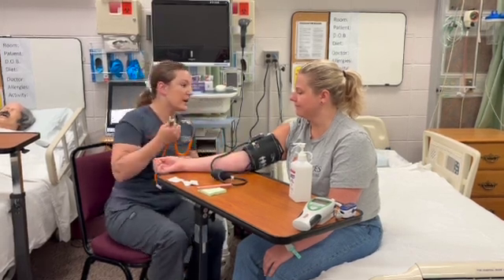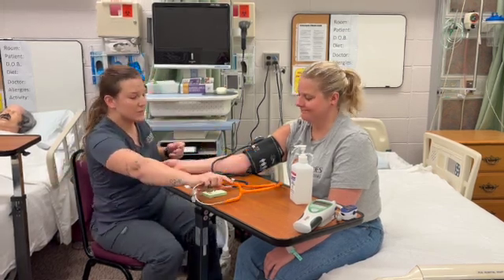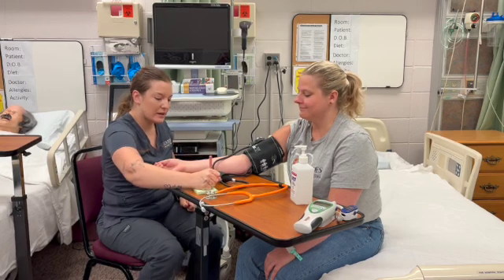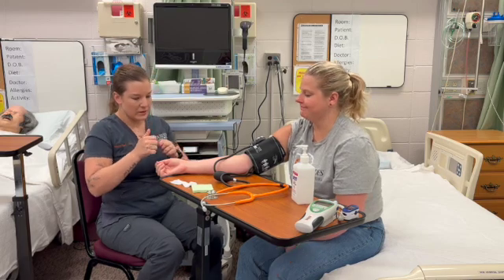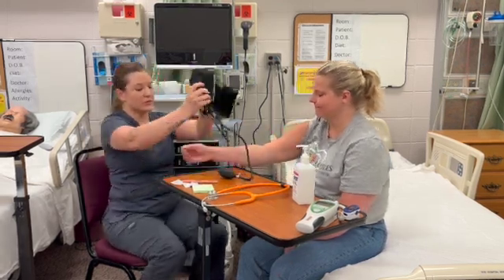Great. So I got 120 over 78, so that's perfect — within normal limits. I'm just going to write that down, and then I will recheck it again before we are completed.